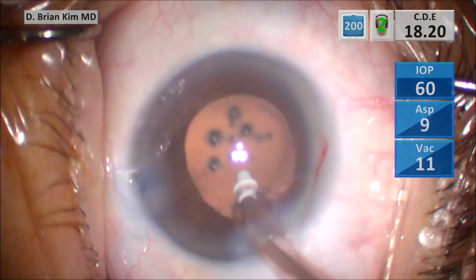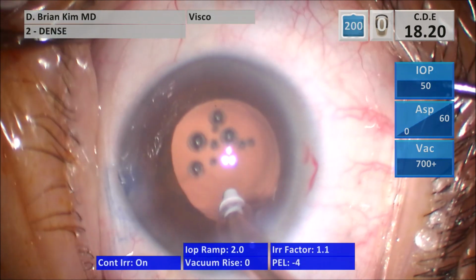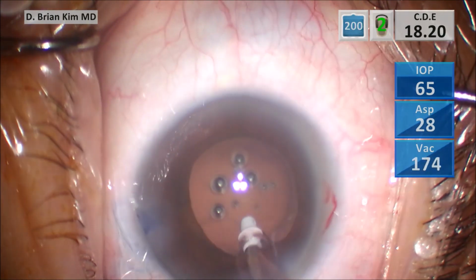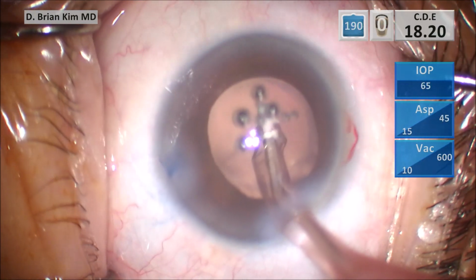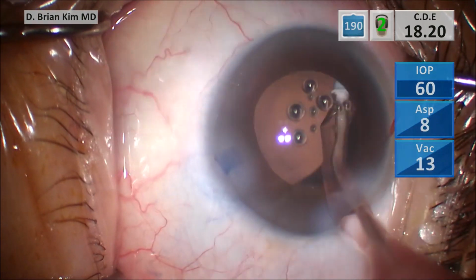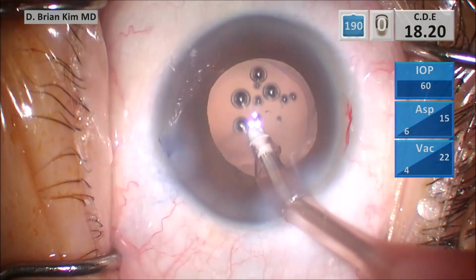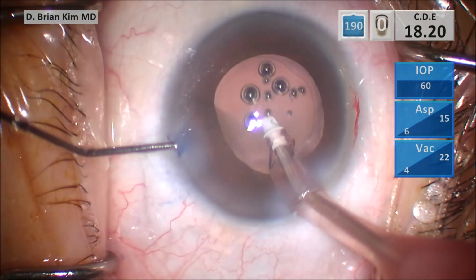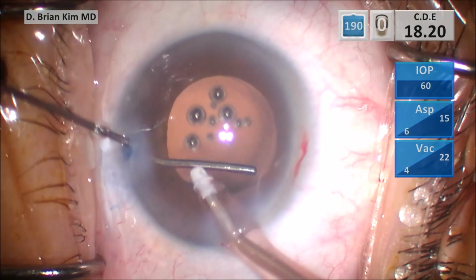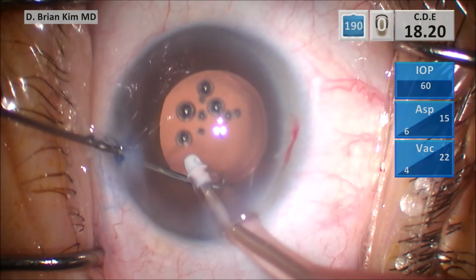So again, I'm polishing under the rhexis edge. You already saw, I already cleaned up the bag in the I/A part of the case, removing the cortex from anterior to posterior, and then peeling off any remaining remnants from the bag. I'm pulsing BSS into the subincisional capsule fornix. Again, you can see those bubbles are still there. I haven't touched them. I left them there on purpose for this video.